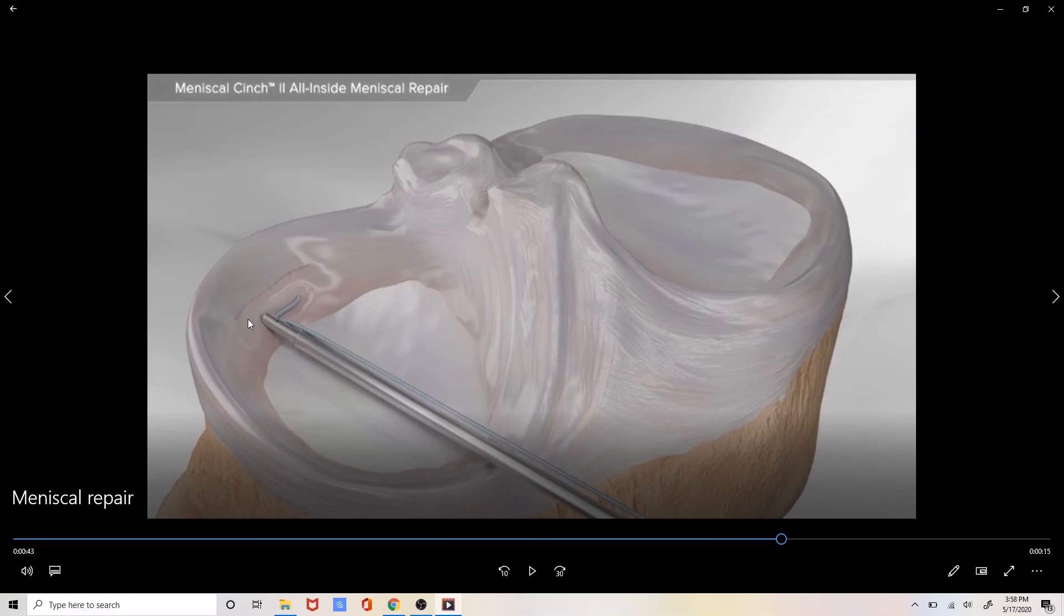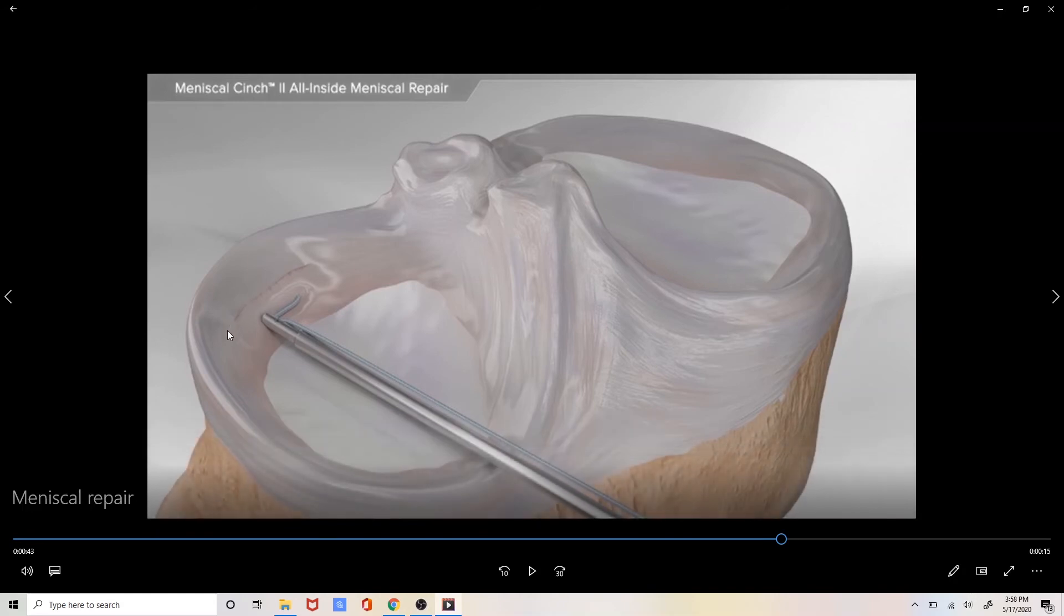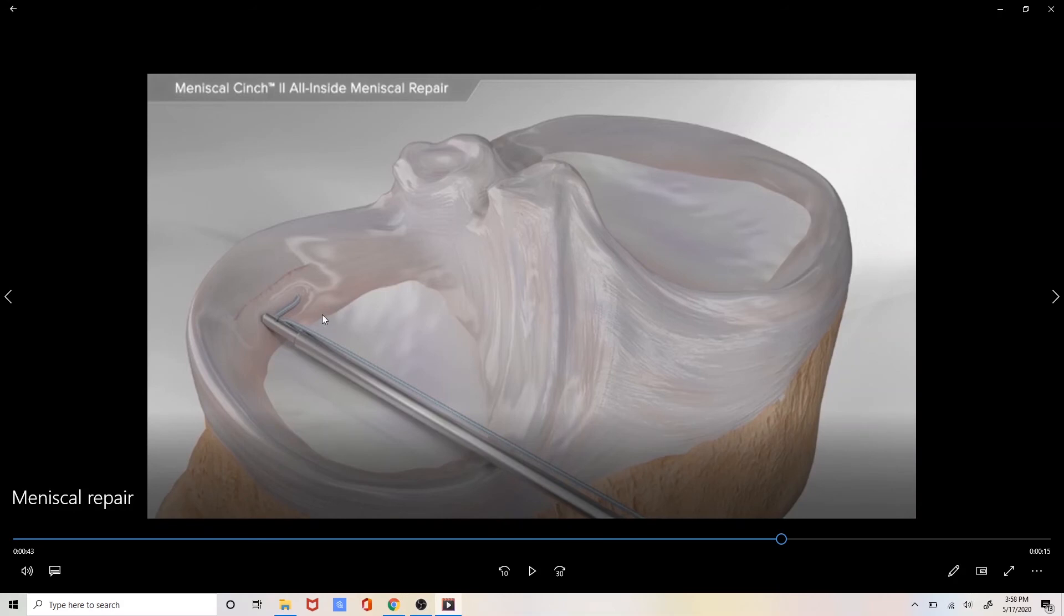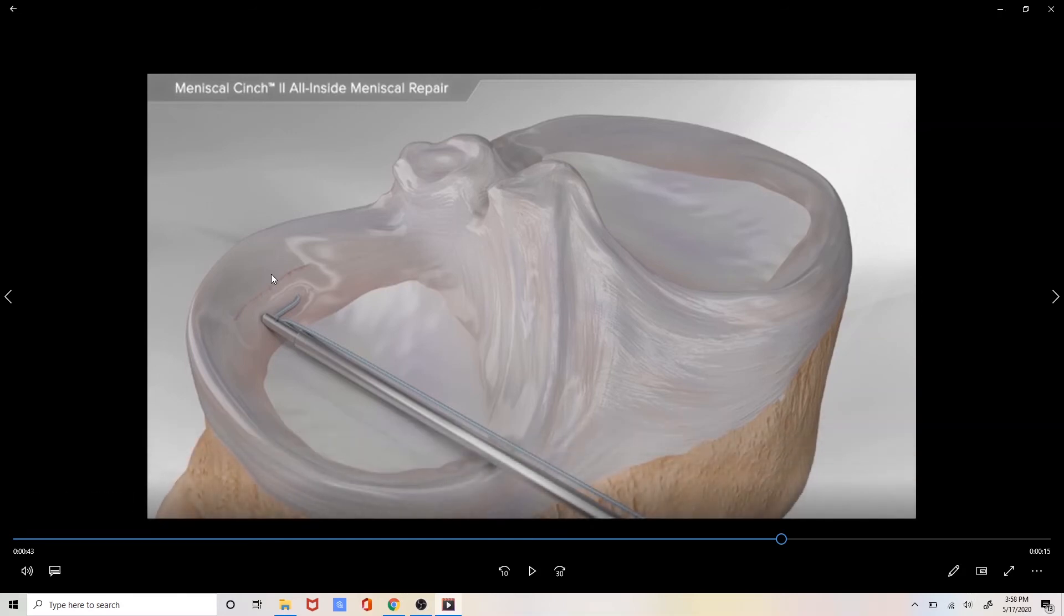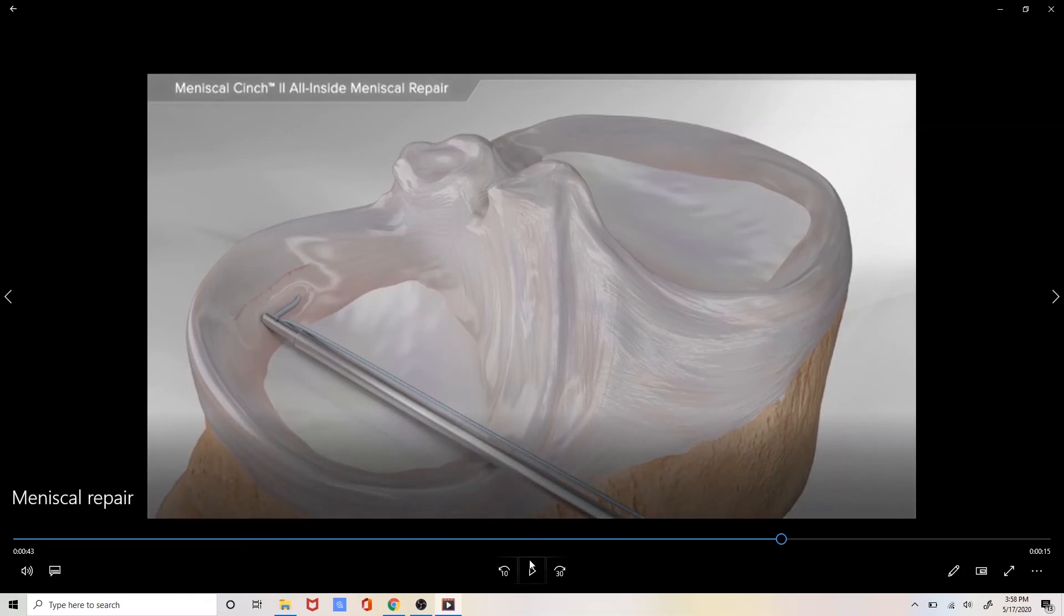In doing a meniscal repair we want to get compression of this tissue in order for the tissue to actually heal. Because placing weight on the knee actually further compresses this tissue we do allow patients to weight bear following a traditional meniscal repair.